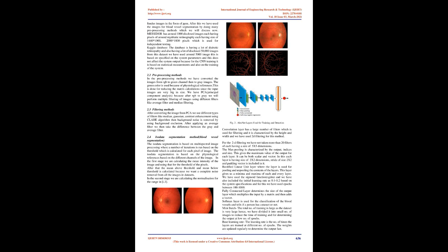and other diseases. The essential parts of the human eye are optical disc, macula, hemorrhage, blood vessels, exudates, and the order of detection is optical disc and blood vessels are easily segmented, but exudates and hemorrhages are difficult to detect because of vast similarity, false detection, and difficult segmentation methods, which increases the complexity of the process of detection.